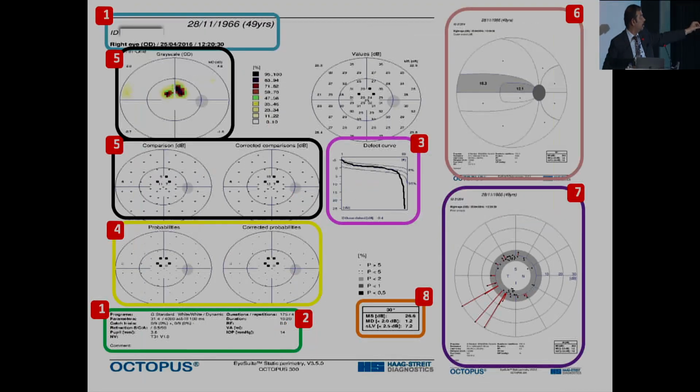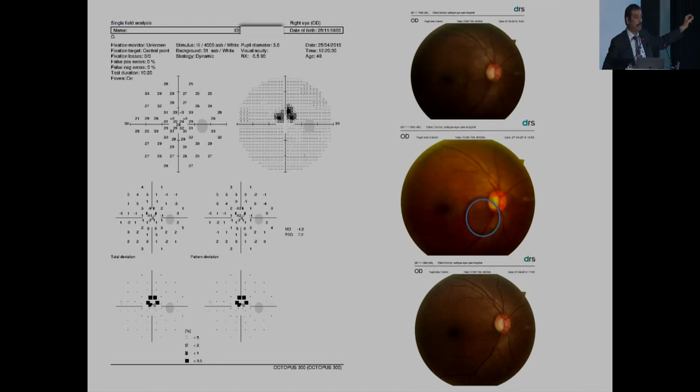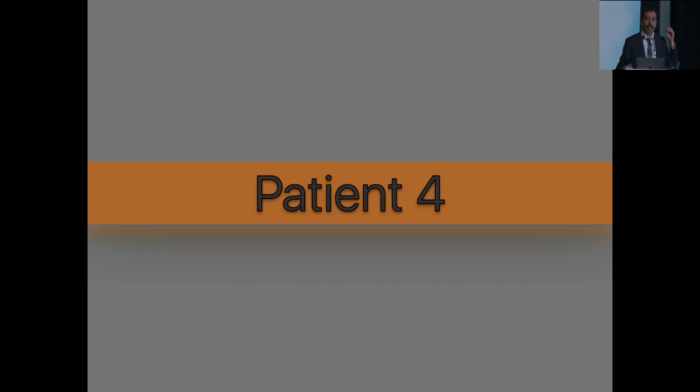What is the importance? I want you to see this photograph again. Carefully you see the RNFL defect, which is very close to the central papillomacular bundle. Any defect which is close to the central papillomacular bundle with normal IOP values is called an NTG pattern. So once you see this central defect, which is close to the macula, that is called an NTG pattern. So you can read this chart very carefully one by one, then you can really understand whether you are discussing POAG, PACG, neurological or NTG; all these things can be picked up.